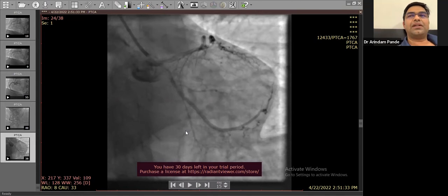So do an FFR for the LCX. It is not mandatory that you send the patient for CABG. Do an FFR to the LAD lesion. If LAD is significant, the mid segment has to be stented, and then you go for bifurcation stenting of the distal left main, because with this kind of LCX, you just cannot put a stent on the LCX and come out. So you need to do a bifurcation stenting. You need to discuss with the patient's relatives, and you should give this option because it becomes tricky.